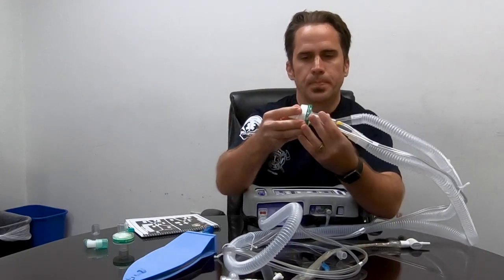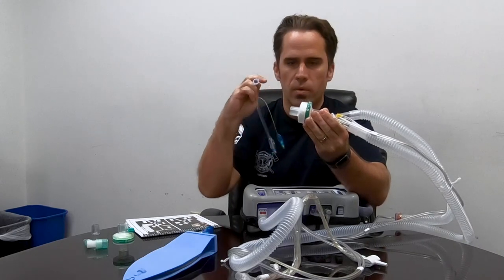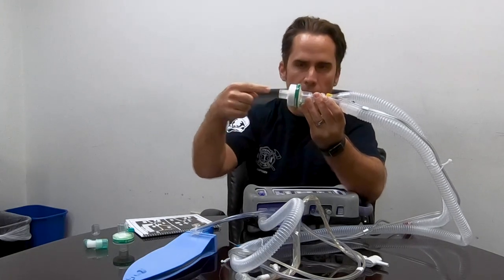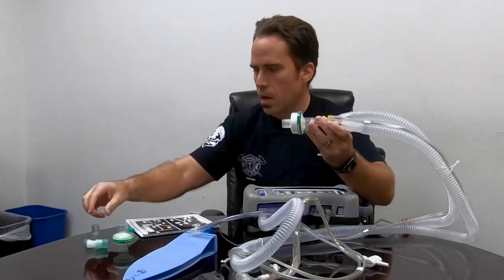Next is our HME — our heat moisture exchanger. What this does is it catches our first exhaled breath that's hot and humid and recycles it back to the patient. That's important because we just put a tube down the throat, bypassing their oral and nasal pharynx, which normally heats, humidifies, and filters the air. If we pump in cold dry air we could really dry out any secretions and give them a bad pneumonia. The HME also filters out whatever sickness or nastiness they have and stops us from being exposed to it.